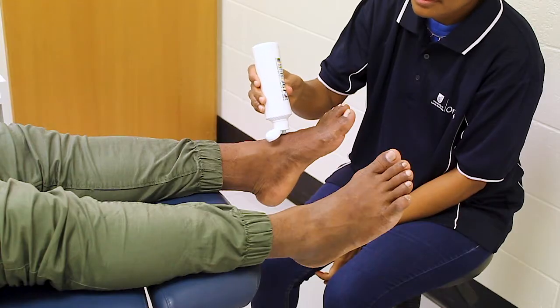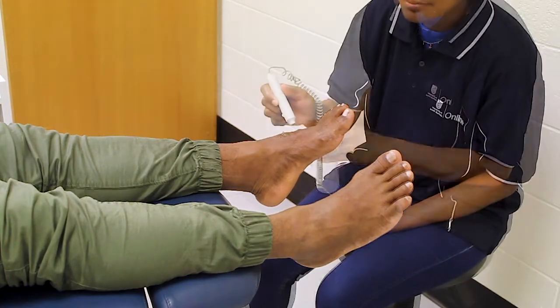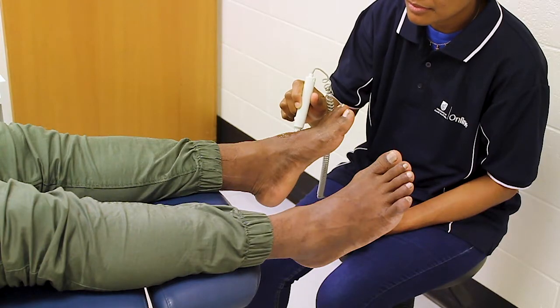Apply a small amount of ultrasound gel to the top of the foot. Turn on the Doppler, increase the volume, and gently search for the pulse. Place the probe on a 45 degree angle against the line of blood flow. This will help amplify the sound.